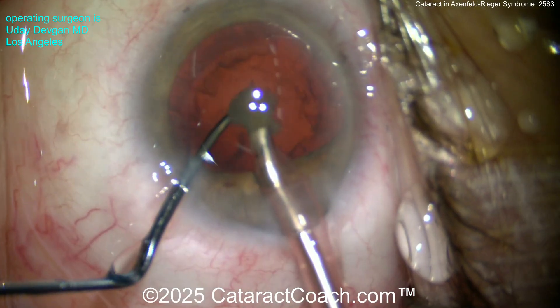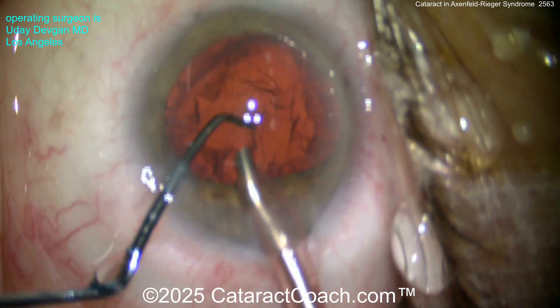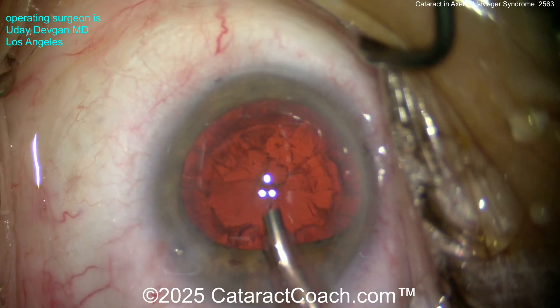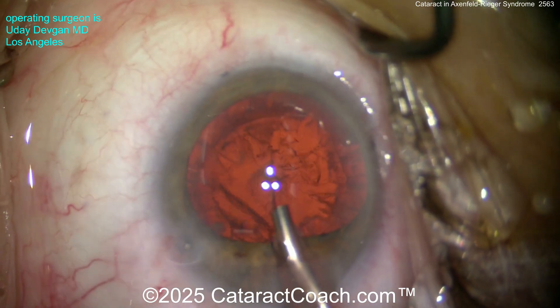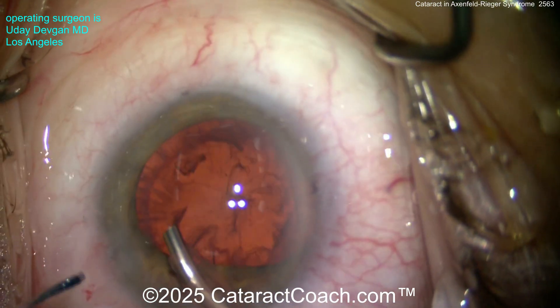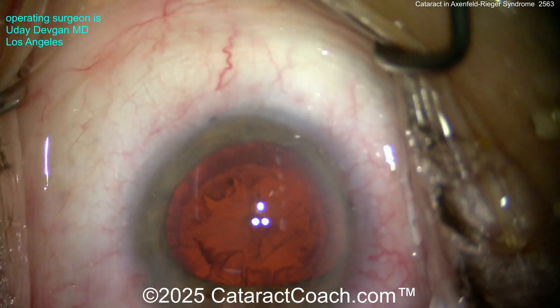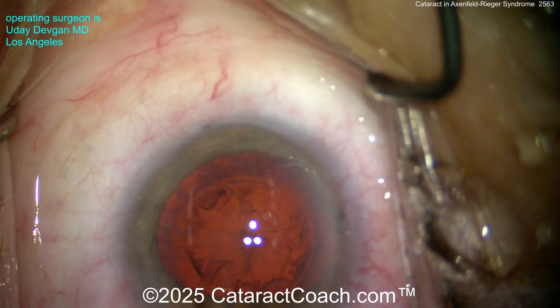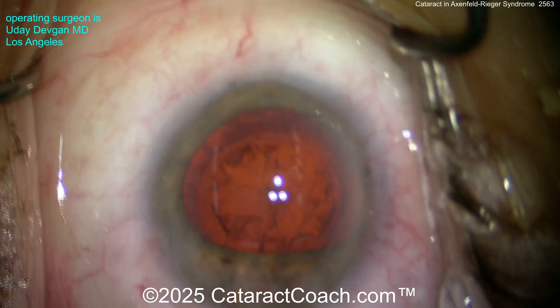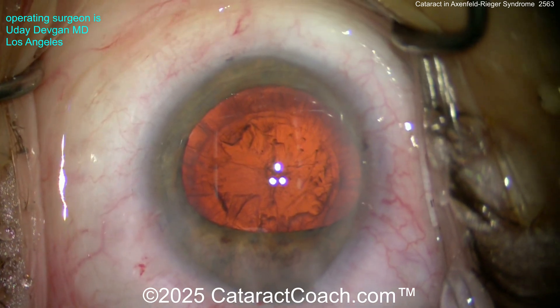This patient started off very myopic with about two diopters of corneal astigmatism. From old records, the patient was able to be corrected to about 20/25 vision with spectacles, which tells me that at least centrally the degree of irregularity in the corneal astigmatism is not too bad — because obviously spectacles could correct it. Now we're trying to get the I/A probe set up and we'll take out the cortex.